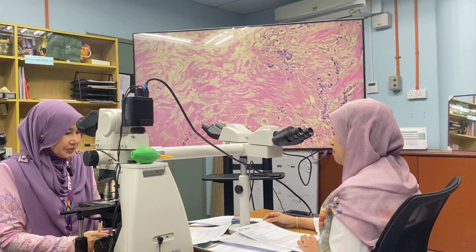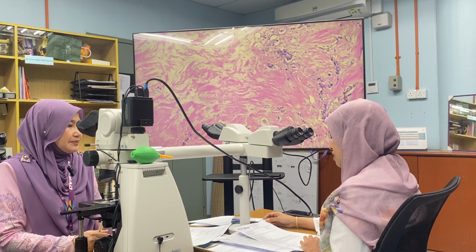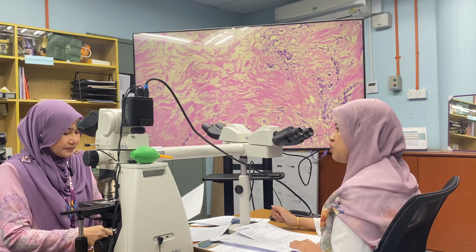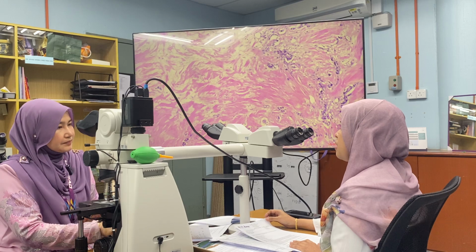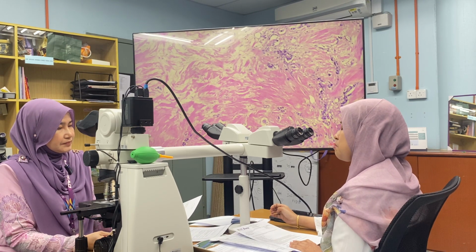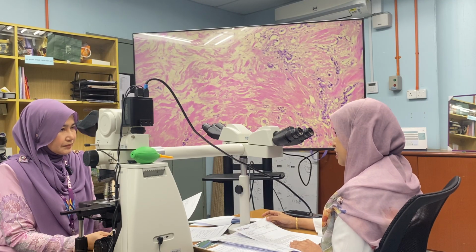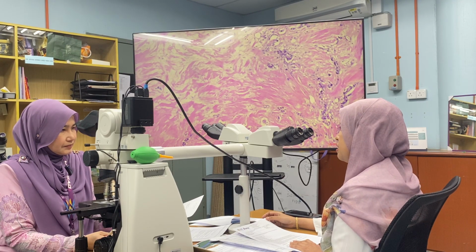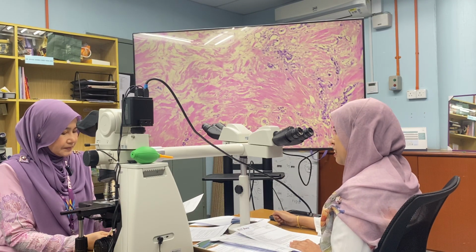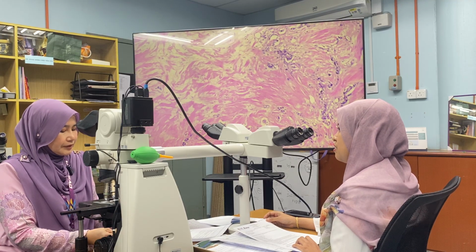So you said that this is grade 2, right? Yes, Miller-Payne. What do you mean by that? Miller-Payne grading is divided into 5 grades. Grade 1, there is no chemotherapy regression effect at all. Grade 2 is up to 30% regression. Grade 3, more than 30 up to 90. Grade 4, more than 90. And grade 5 is the complete pathological response. All right, that's good.